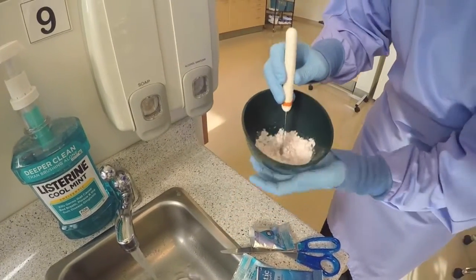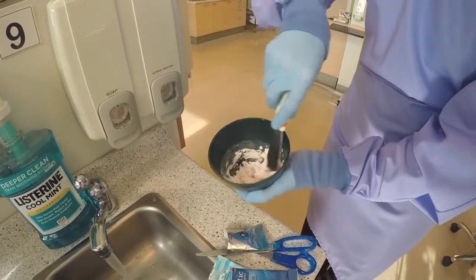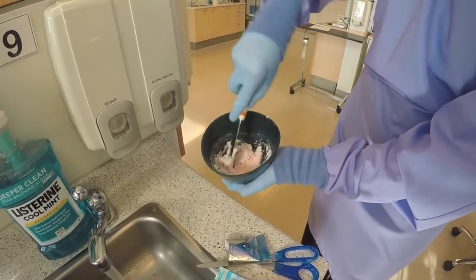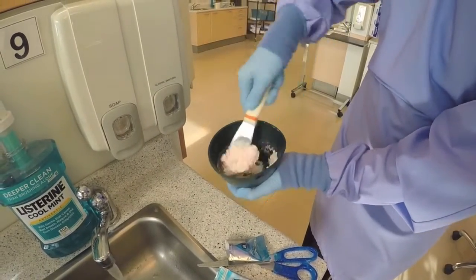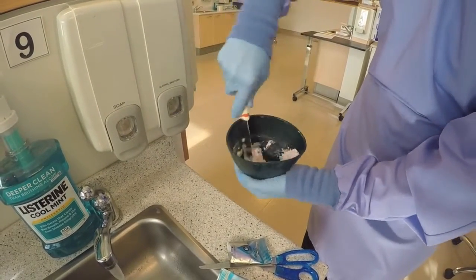While holding the mixing bowl from the bottom with one hand, take your spatula and begin to mix. You want to press the material on the sides of the bowl while mixing to get rid of any air bubbles. Do not spend too much time on these steps because the alginate begins to set as soon as you mix with water.